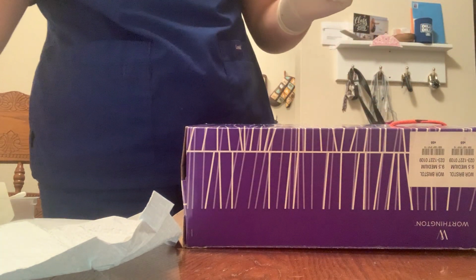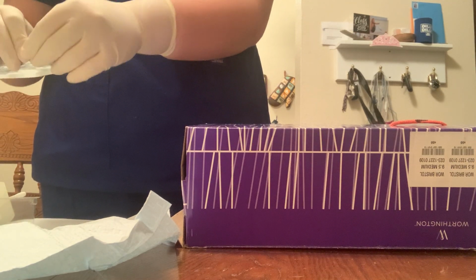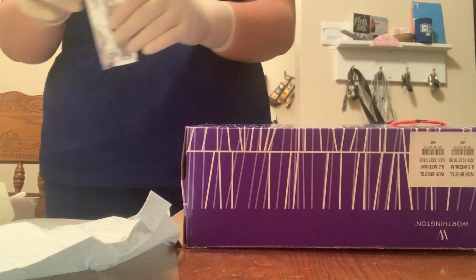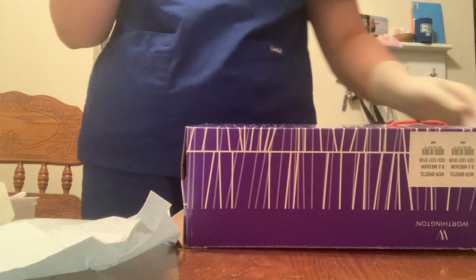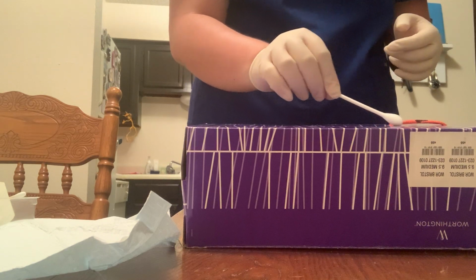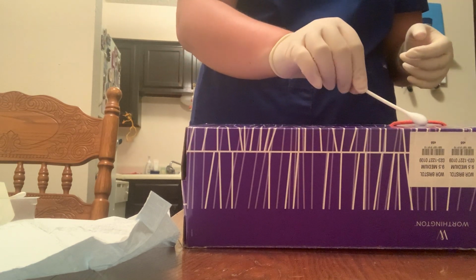Okay. So first thing I'm going to do is cleanse the area with alcohol. Now I've disposed of this into the trash can. The first thing I'm going to do is swab it with alcohol. So I'm going to start at the insertion site, and I'm just going to go in circular motions around it, going further out, making sure not to cross back over.